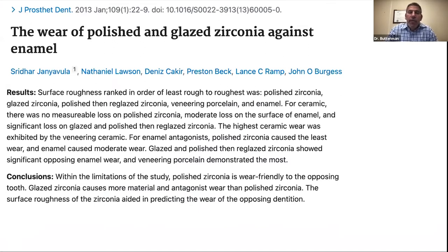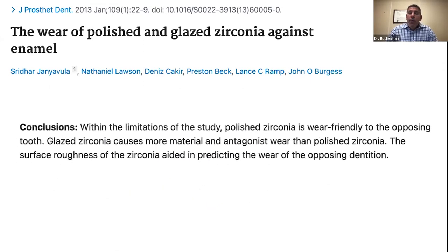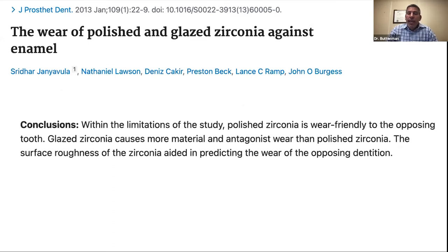I know a number of you probably know Nate Lawson and John Burgess. So these names are familiar to you guys. This was a really, really good study. And one of the things that they found was that if you polish zirconia, it will create a more wear friendly surface to the opposing tooth. So it'll cause less damage to the antagonist tooth if you polish it as opposed to glazing it. So my preference is going to be to have a well-polished surface because think about zirconia, it's so hard.